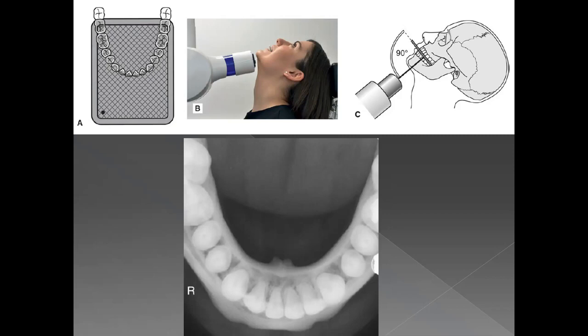So they may have to get up for this. But this is one modification I can suggest to you, which will work in patients who have, let's suppose, some neck issues in which they cannot flex or extend their neck that much, or if you're suspecting some sort of neck injury in a patient and you want to evaluate displacement of the fractures in the mandibular symphysis area. And you want to do an occlusal. So this is one technique that you can do, which will not require neck extension. All right.